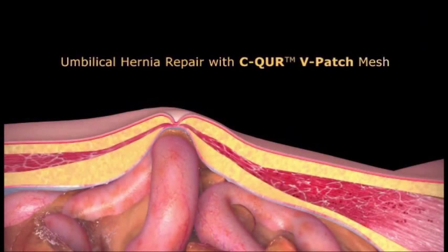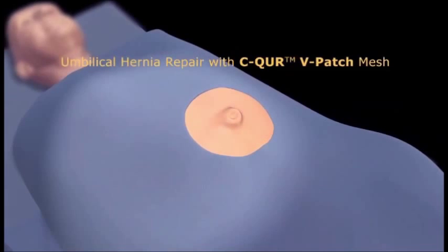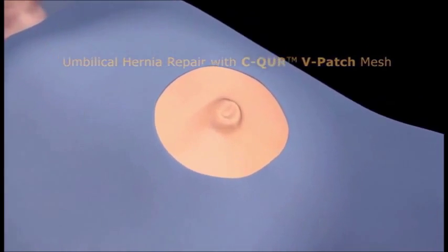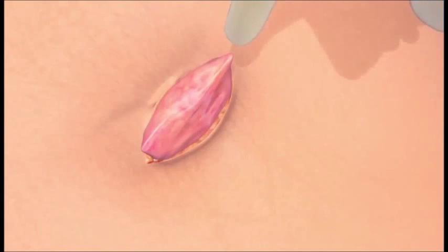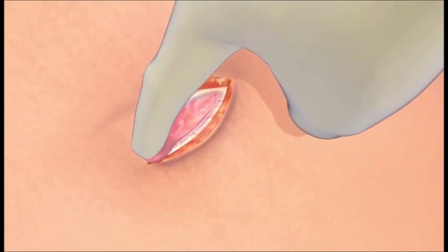The following procedure shows the C-QUR V-Patch being used for an open umbilical hernia repair. First, a small incision is made over the hernia. The hernia sac is then dissected free from the surrounding tissue and reduced into the abdominal cavity.